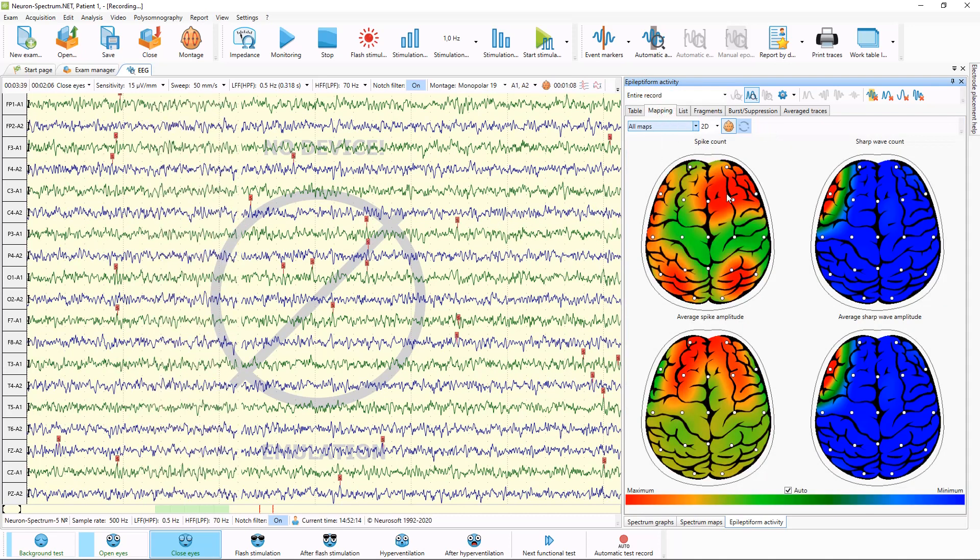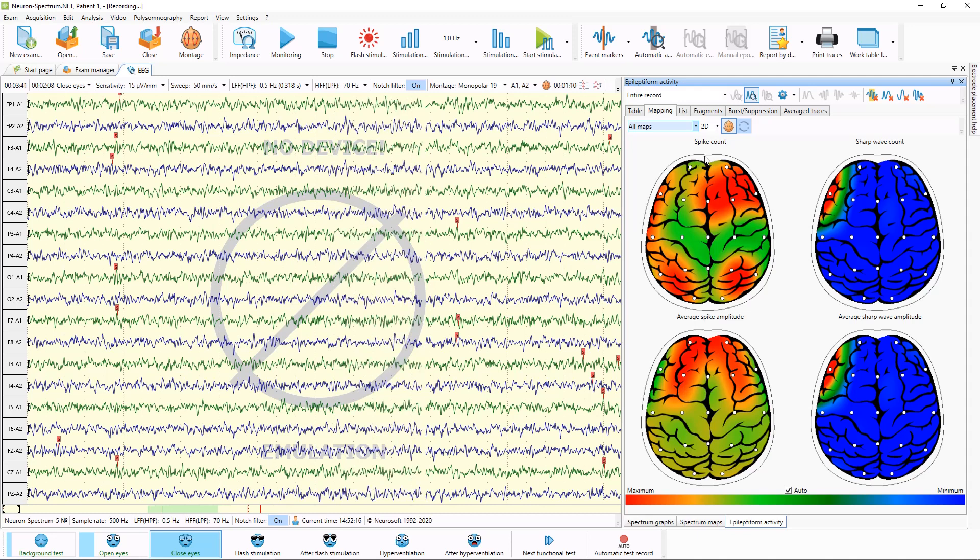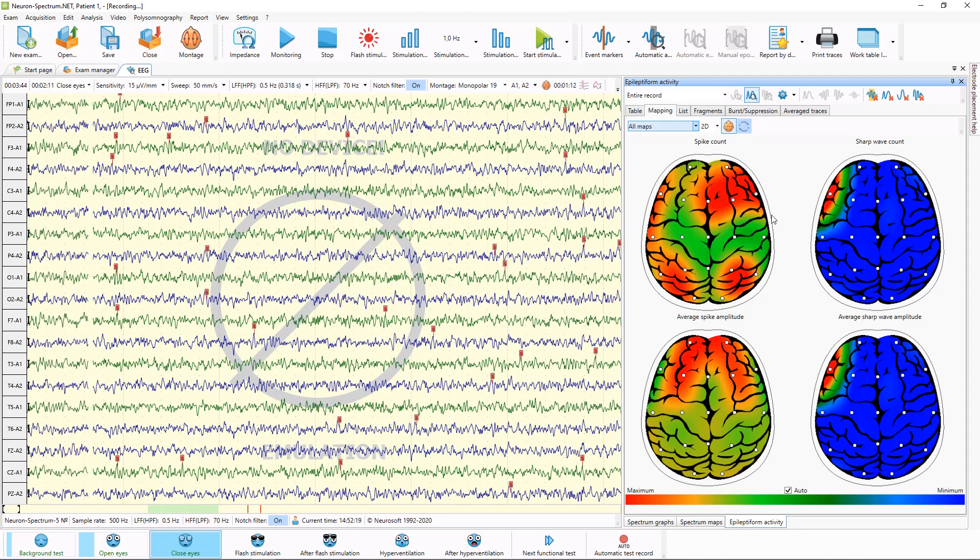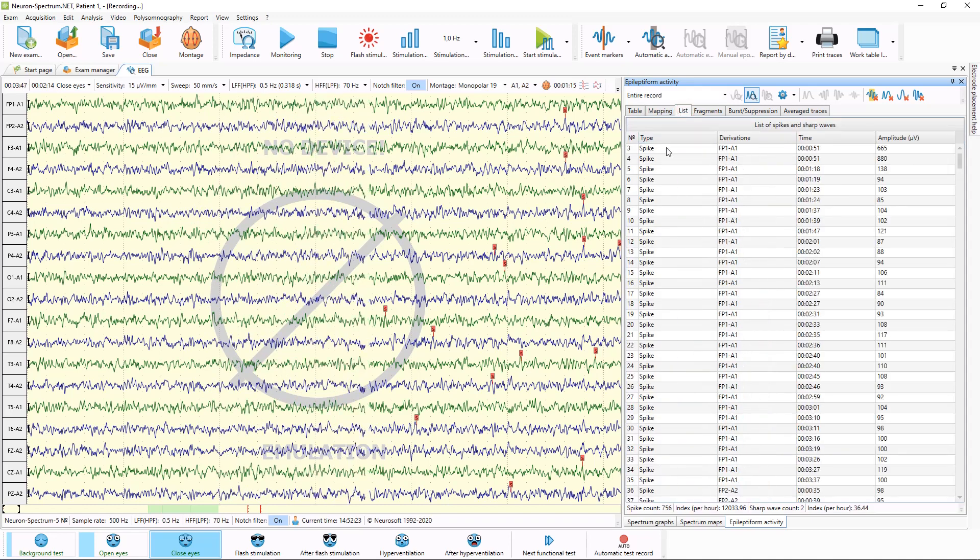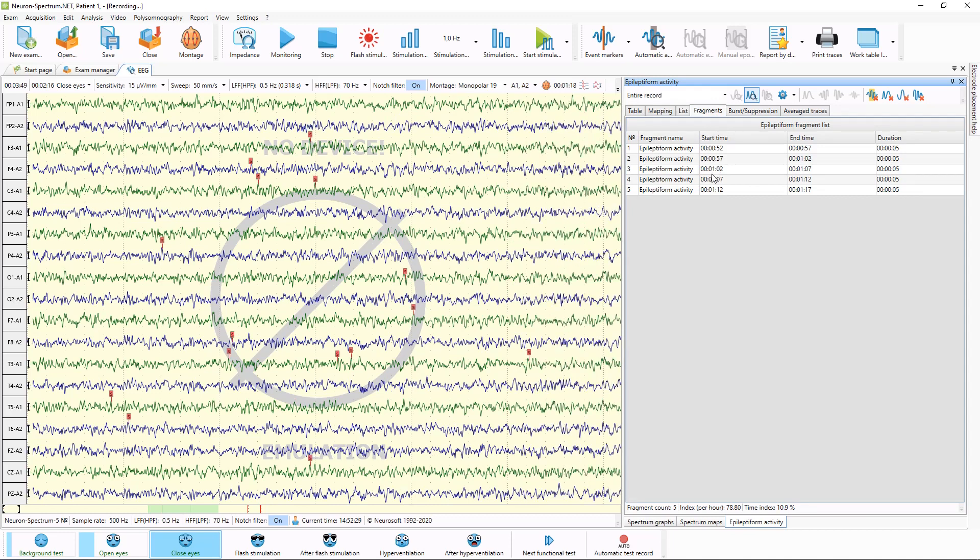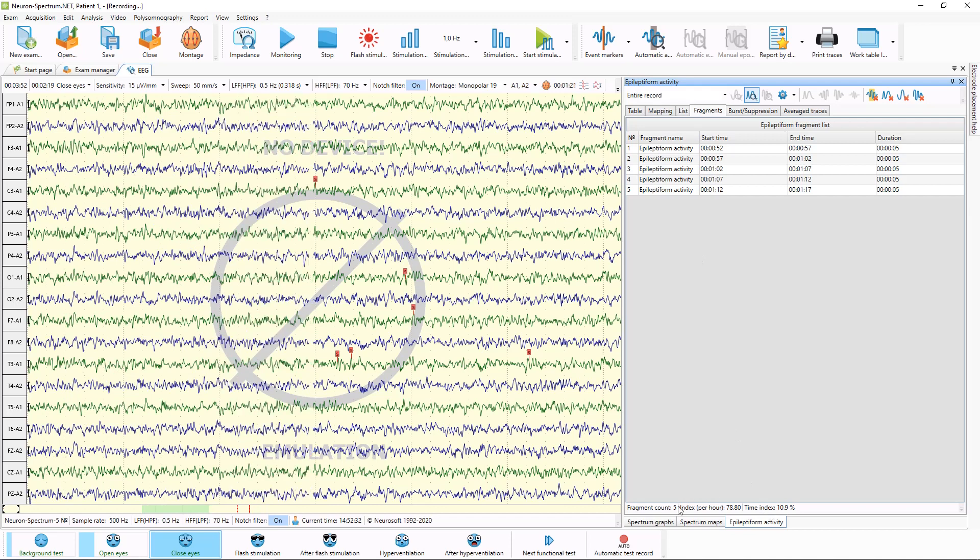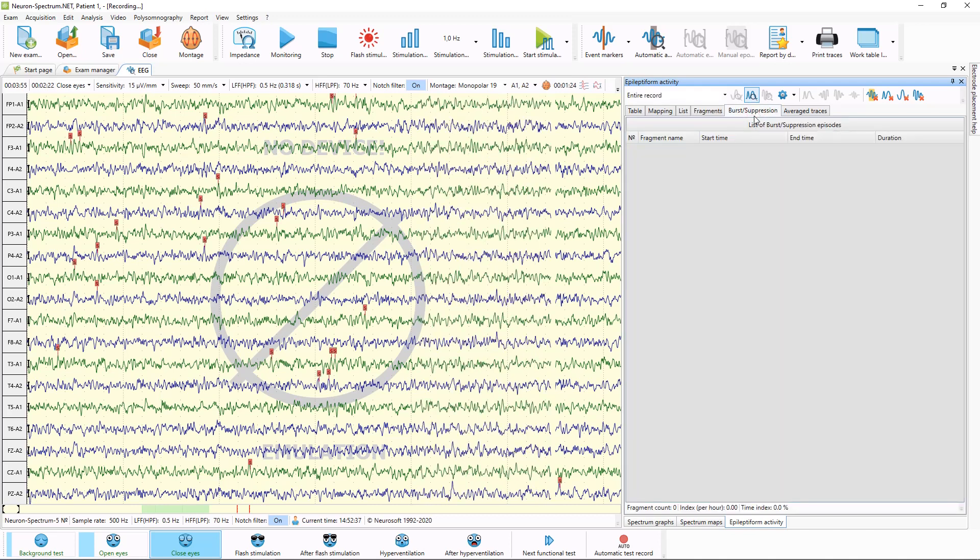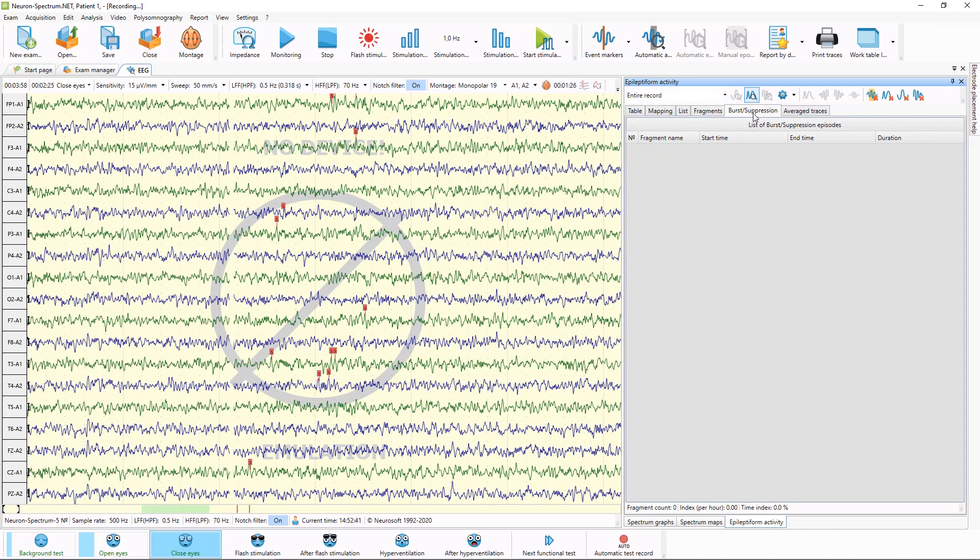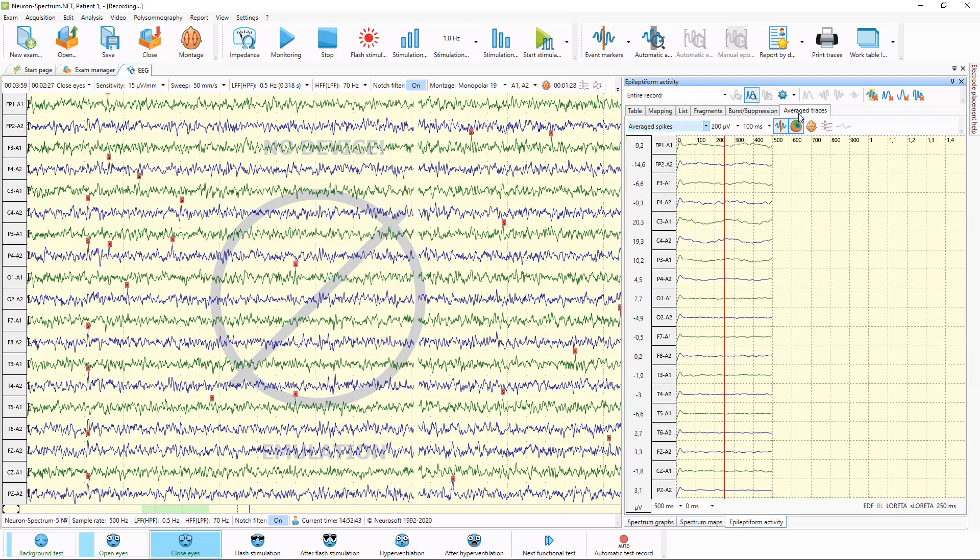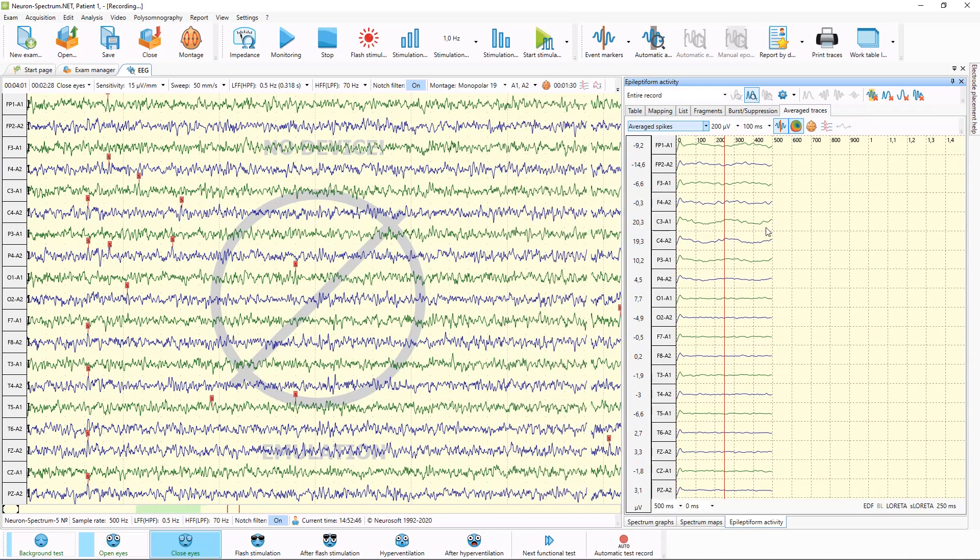On mapping page, you can see results of mapping of spikes count and spikes amplitude. Here is list of all spikes and sharp waves, and here is selected fragments of epileptiform activity which also is written here. Also this software allows you to select burst suppression episodes and make averaging of all spikes.